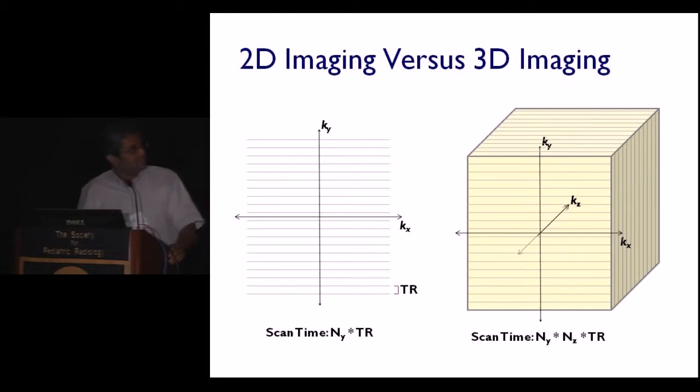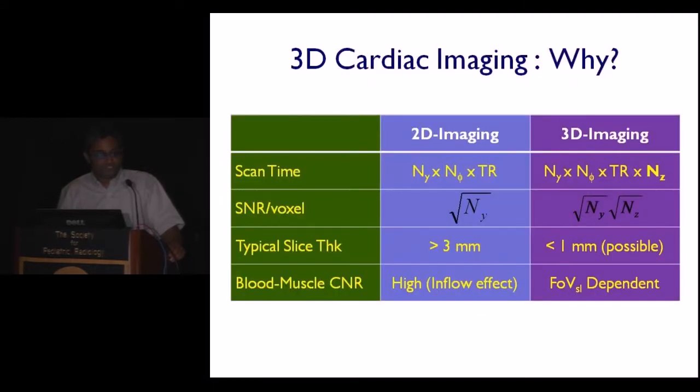So let us look at a coronary MRA. What are the requirements? These vessels are small and tortuous. That means that we need to get a lot of pixels over a large area, which means long scan times. Secondly, there is cardiac motion with respiration, and respiratory and cardiac pulsation. Also, blood flow in the coronary arteries is limited to a small portion of the cardiac cycle, so our acquisition duration is limited. We need to get a large number of phase encoding steps, and we also need gating.